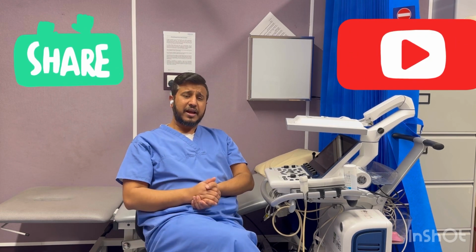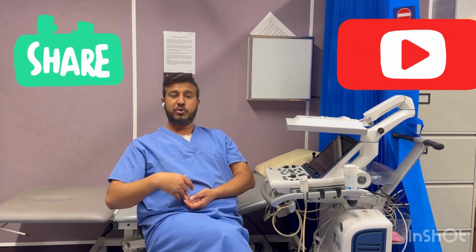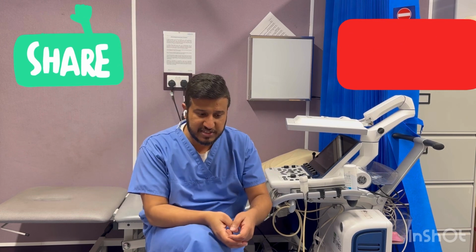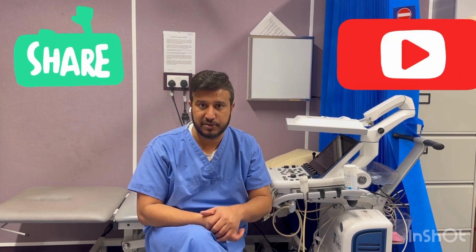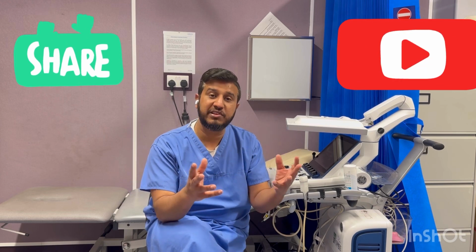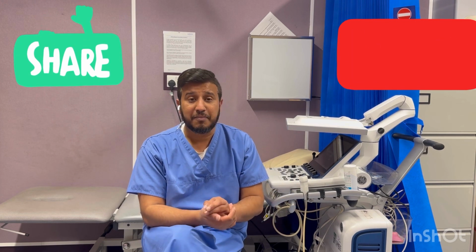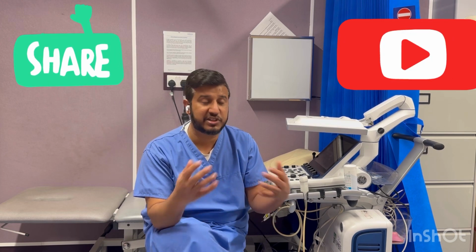Okay, there are more views, like the RV modified view, how to get the short axis view at subcostal views, and how to get, for example, the pulmonary veins. These things you will learn by doing more practice. Okay, so this is all about the imaging. In the next vlogs I will try to show you the images, what we see in every image, like where you see the ascending aorta, where you see the mitral valve, and all these things in the next vlog. Okay, thank you very much, and after that we will be starting our echo lessons.